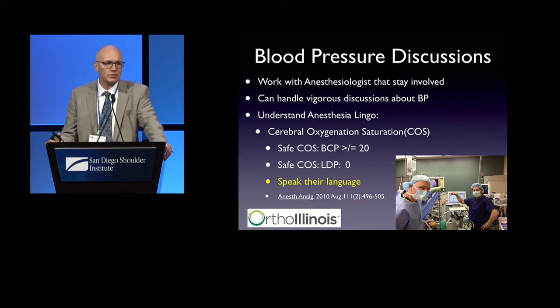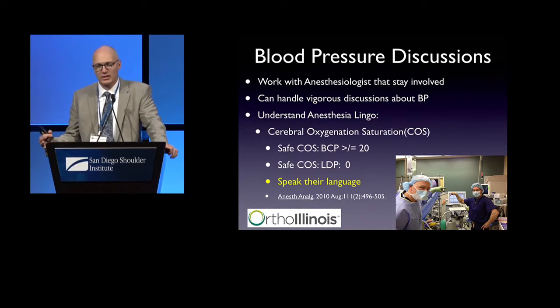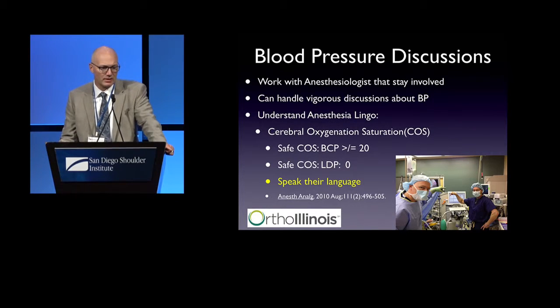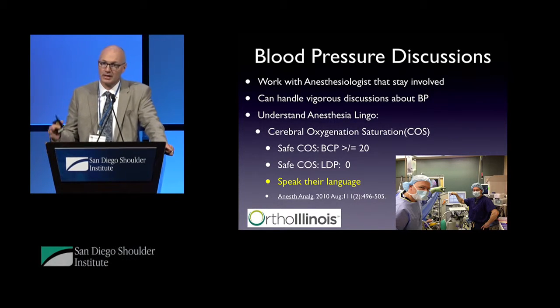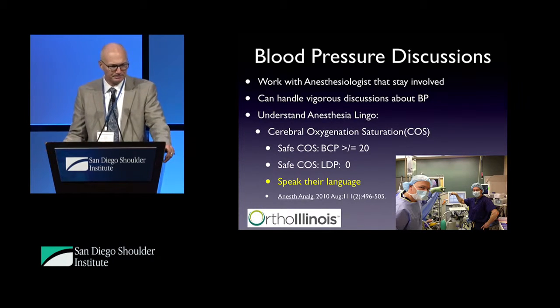Oftentimes you'll get into a discussion with an anesthesiologist who's uncomfortable with things, that being blood pressure discussions. And you can see here I'm pointing at the monitor and the anesthesiologist is pointing at the patient. And we're having a vigorous discussion about cerebral oxygenation saturation, that being what's safe and what isn't. So in the beach chair position, it's typically greater than or equal to 20, whereas in the lateral decubitus, it's 0, because the head and the heart are at the same level. And so you have to speak their language and be able to talk to them in a way they can understand so that the two of you are on the same page.